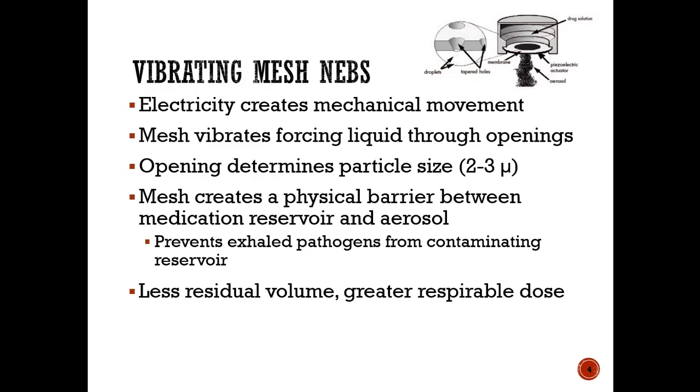Vibrating mesh nebs. So these are very, very cool, I have to say. We use a version called the Aerogen at Gunderson, but I'm a big fan of these, especially in the NICU, because they are so quiet. They don't add flow to the circuit. They're very nice for not waking up kiddos.